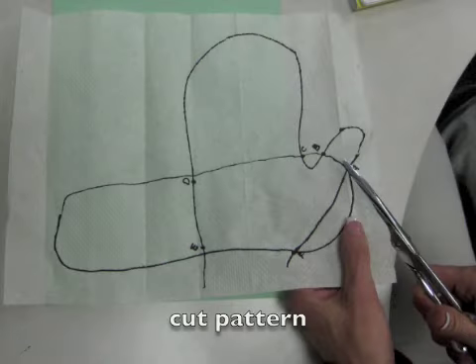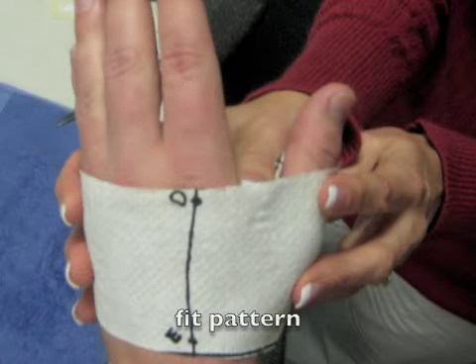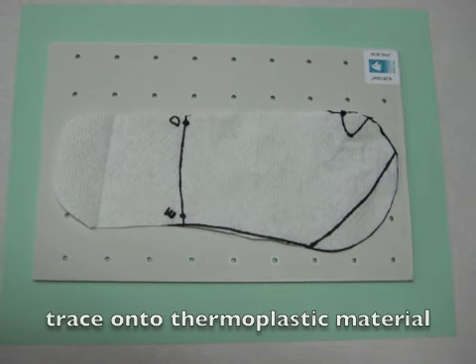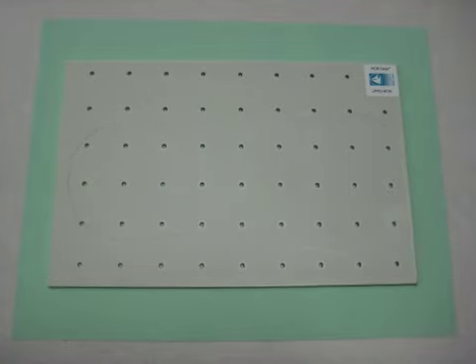Cut out the pattern along the line that you have just drawn. Fit the pattern on the person's hand and make sure that the pattern can join in the web space between the thumb and the first digit. Trace the pattern onto the thermoplastic material. Remember that it is better to have too much material and have to trim away than to have too little.